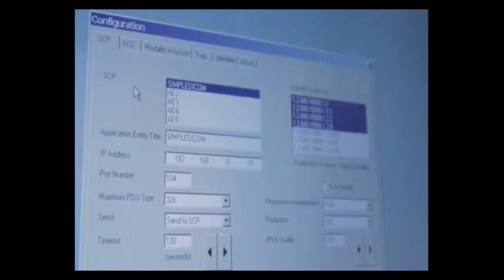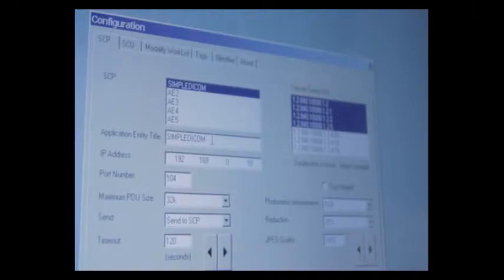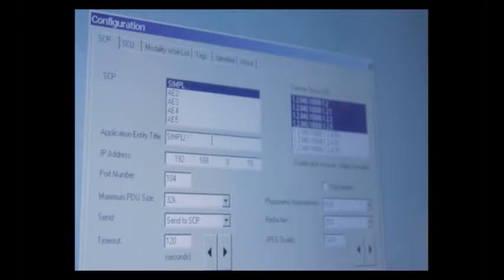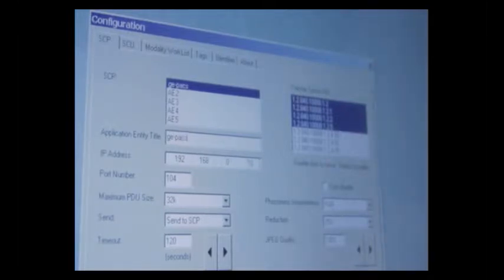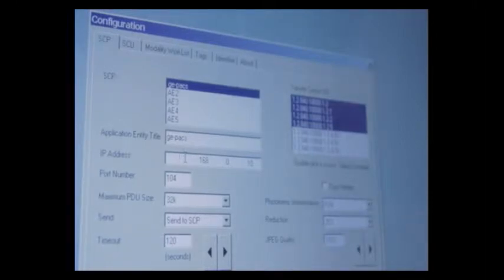The first step is to click in the box that says AETitle and backspace out Simple DICOM, which is a test setting that we use here at the factory. Type in the name of your AETitle for your image send server. In this case, I'm going to use GEPACS. Then click in the box where the IP address goes and type in the IP address. Let's just say it is 192.168.0.10.